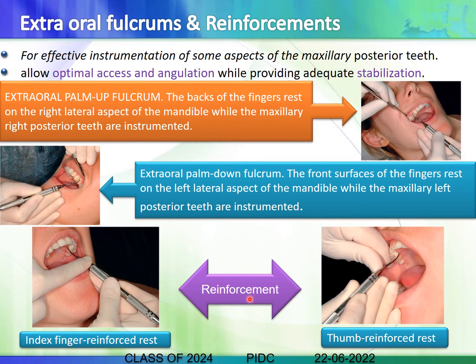There is also reinforcement which can be given with the help of the non-operating hand's fingers. Index finger reinforcement, you use the index finger to reinforce, and thumb reinforcement, the thumb of the non-operating hand is used to reinforce the instrument.